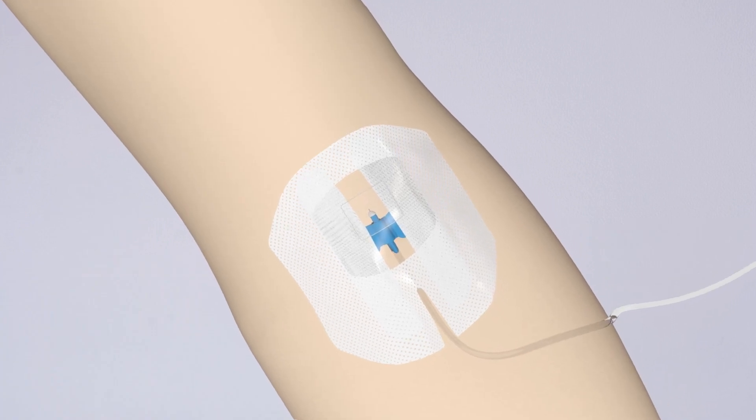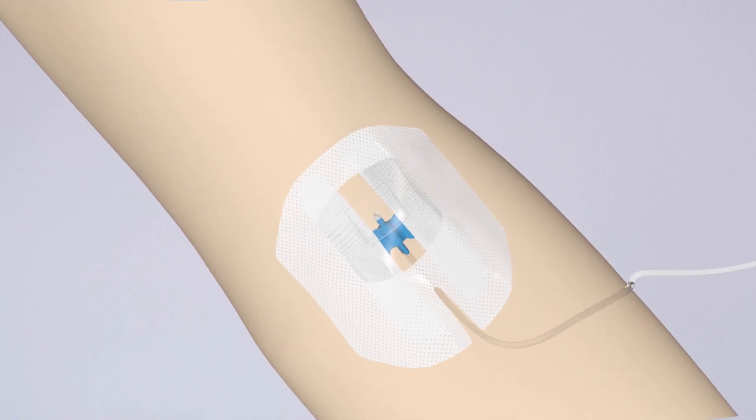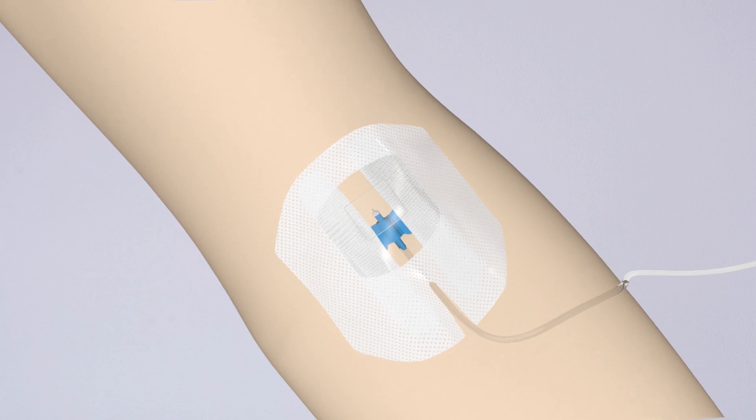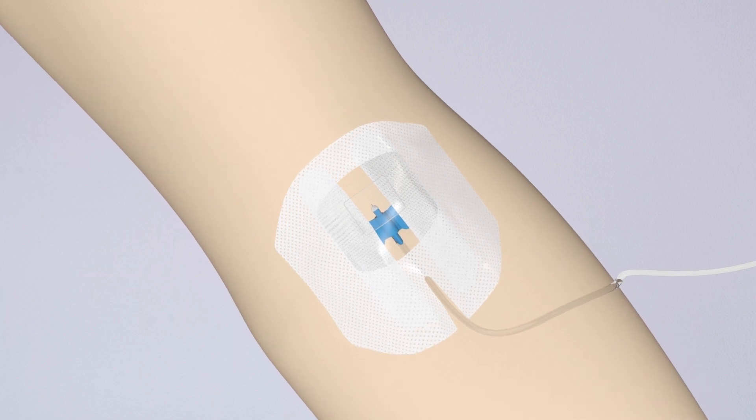AbsoClear IV is designed to maintain securement by preventing edge lift, flexing with patient movement and managing moisture underneath the dressing.